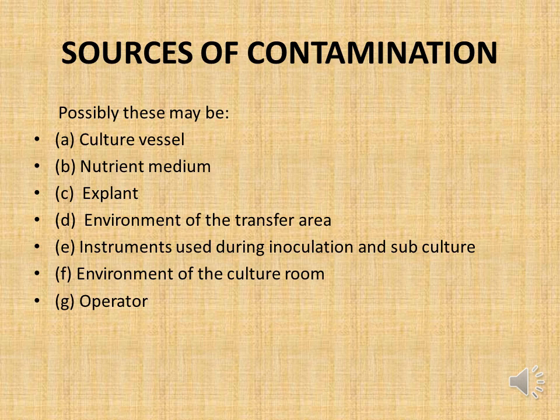The possible sources of contamination are culture vessels, nutrient media itself, the explant, environment of transfer area, instruments used to handle plant material during inoculation and subculture, the environment of culture room and the operator.